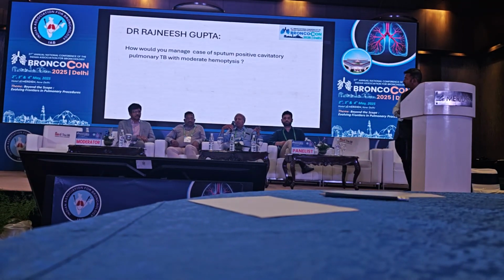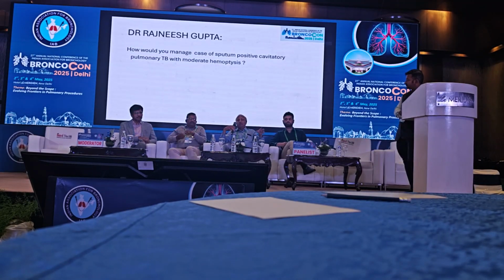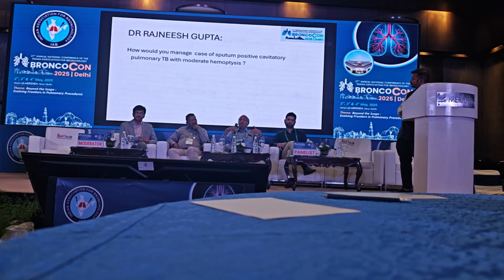So bronchoscopy is helpful, we can know exactly which segment of the lobe the bleed is coming from. If that doesn't help, then we can go for rigid bronchoscopy or CT. Then we have therapeutic interventions we can do via the bronchoscope. Cold saline lavage can be easily instilled, which will cause vasoconstriction. Then we can put topical adrenaline. Then we can use hemostatics, again topically.